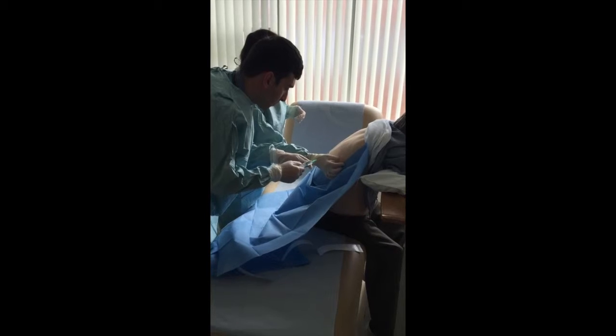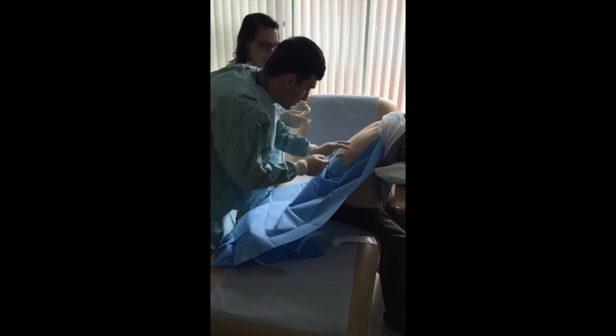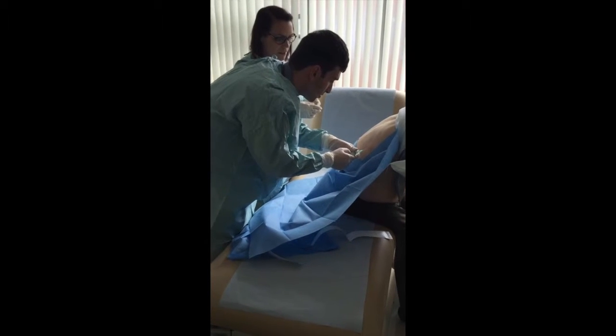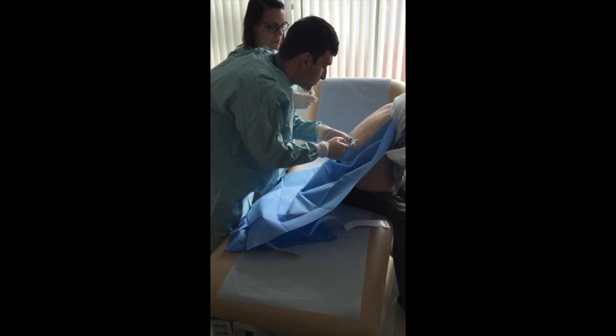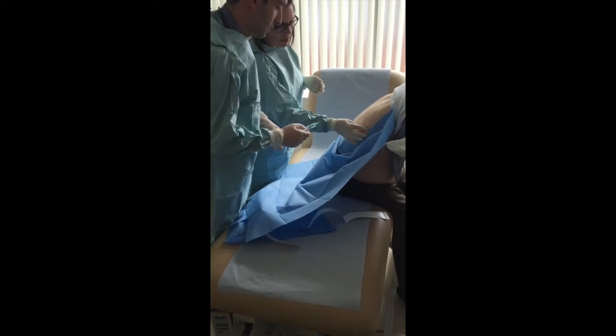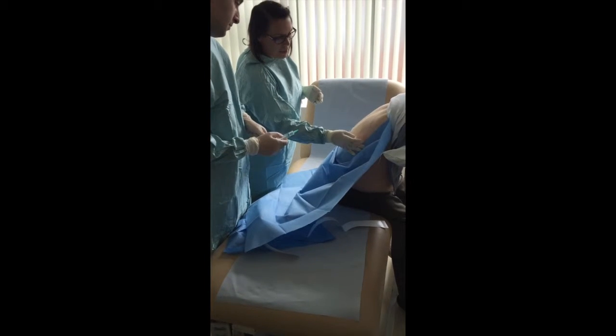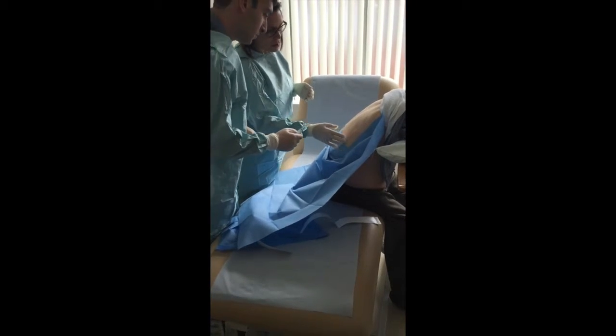Just check for a local anaesthetic effect now. You're going to use the same puncture point, so just check if there's any sharpness. Can you feel me touch it there? You can? Still feel that, yeah? Okay, just give it another second to work. Is it sharp or is it just the sensation of being touched? The sensation of being touched.